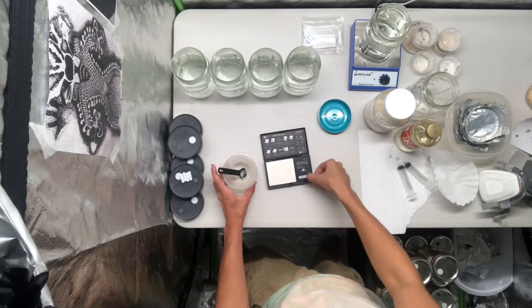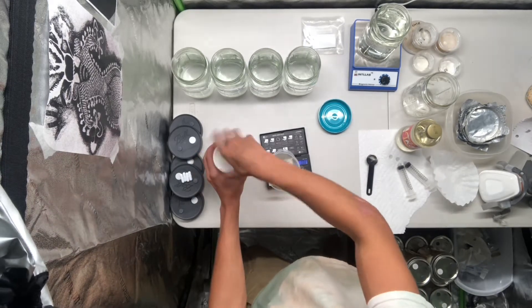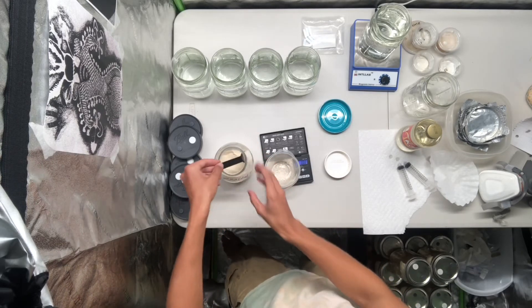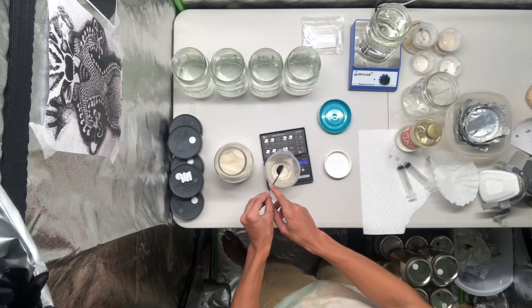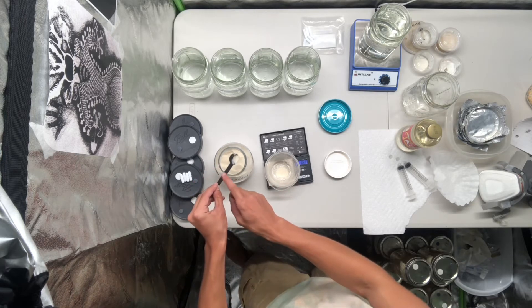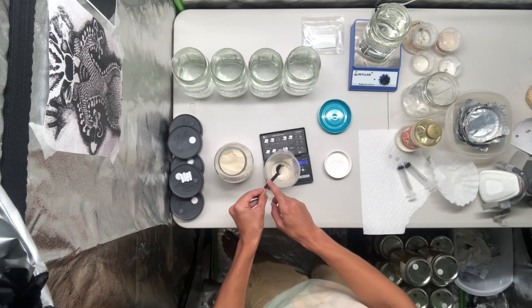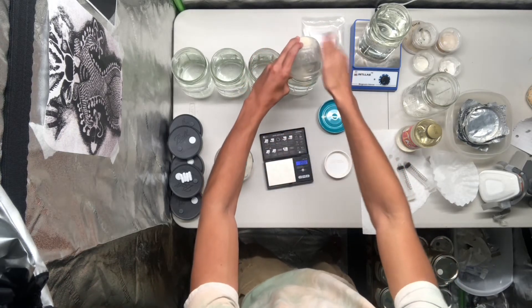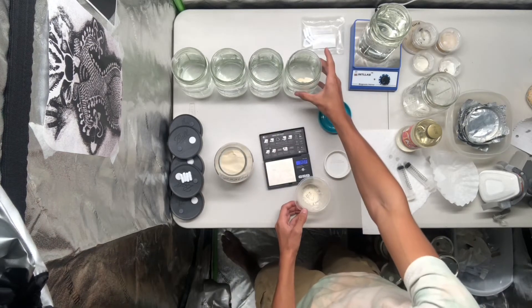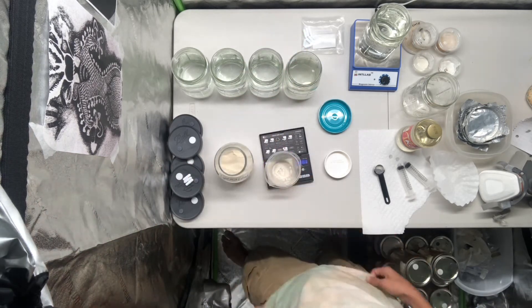Next up is the light malt extract. You want to use about one gram per 600 milliliters of water with the light malt extract, and since we have 700 milliliters we'll be using 1.16 grams per jar. So you can just tare the scale and measure out about 1.16 grams, then add it right in. You can see it starting to dissolve in the water. I'll add the stir bar as well and get these three jars set up.